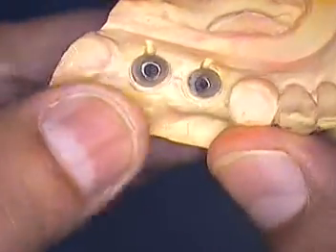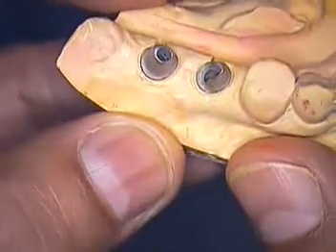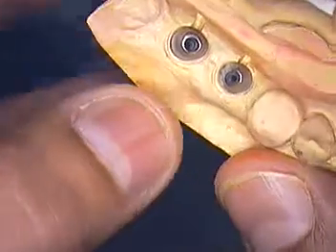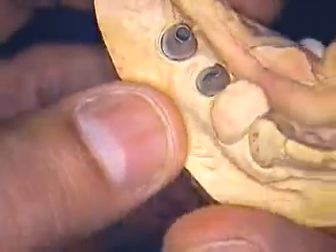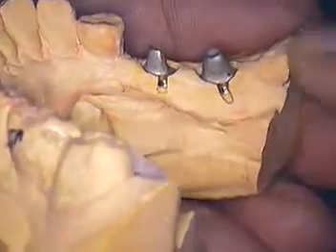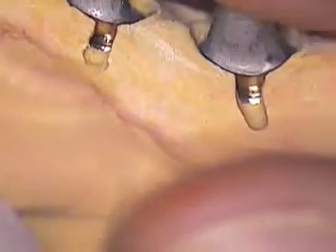It kind of mimics the solid model. Notice we have a solid model here without the gum tissue — just looking at this on a hard tissue model really does help us visualize our work. The linguals have their normal cutouts so you can see how the abutments are seated all the way, and we always double check that. So we're ready — ready to try it in.